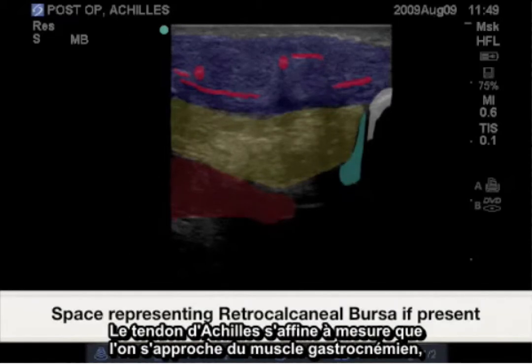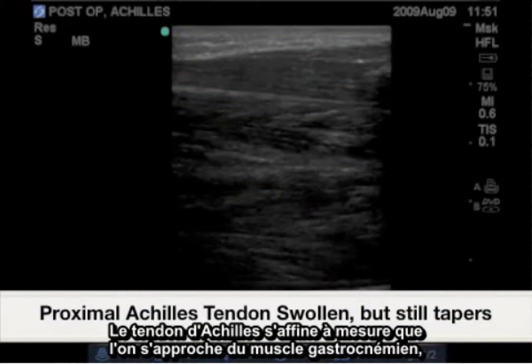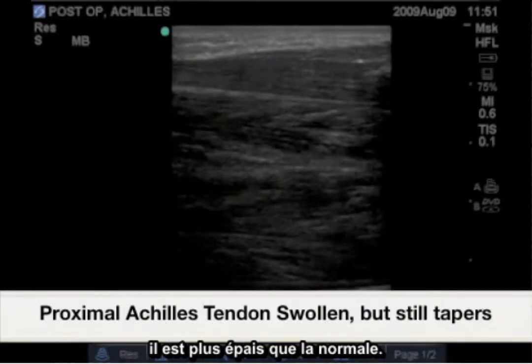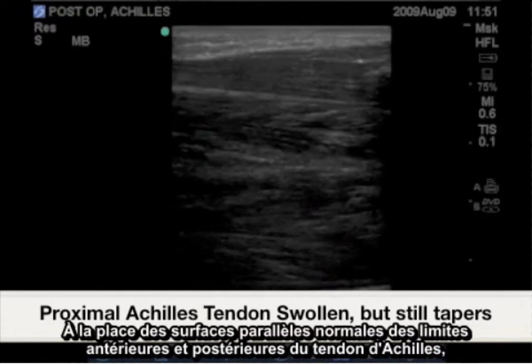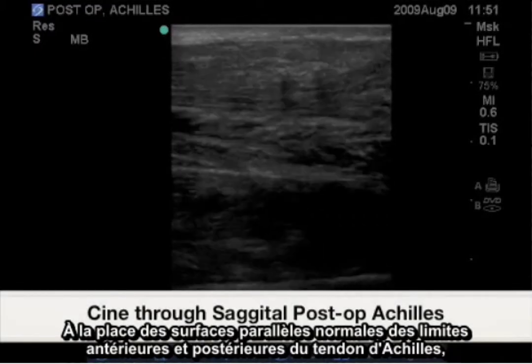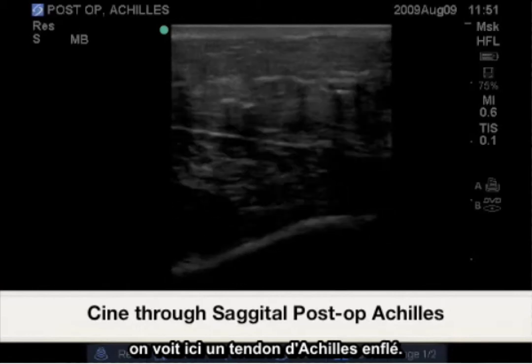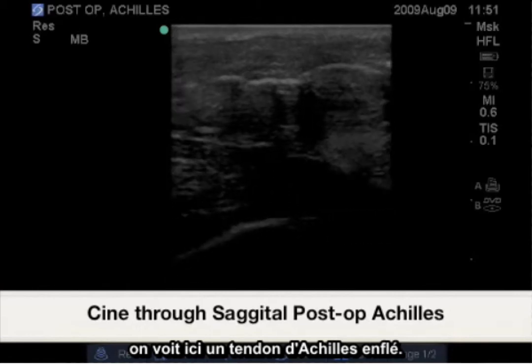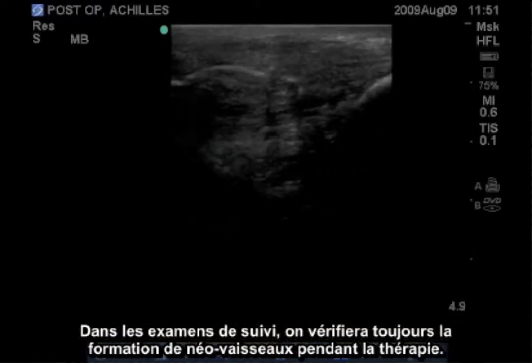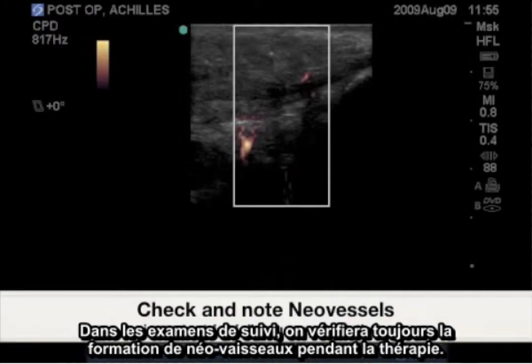The Achilles tendon still tapers as it reaches the gastrocnemius, only thicker than in the normal images. Instead of the normally parallel surfaces of the Achilles tendon's anterior and posterior margin, we now have a swollen Achilles tendon. In follow-up examinations, always check for neo-vessel formations as therapy continues.